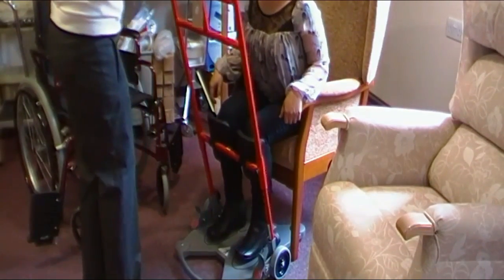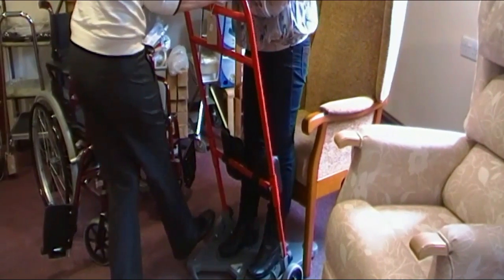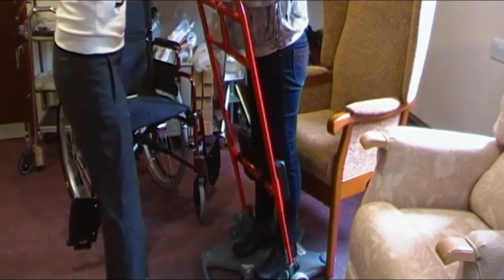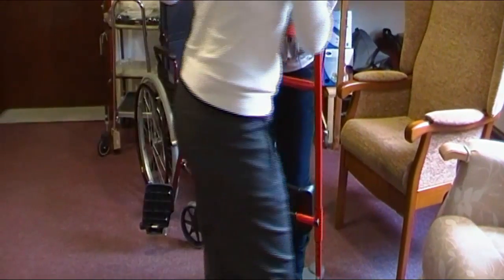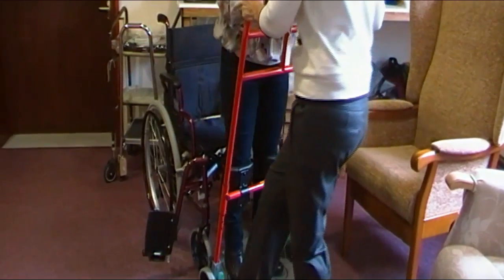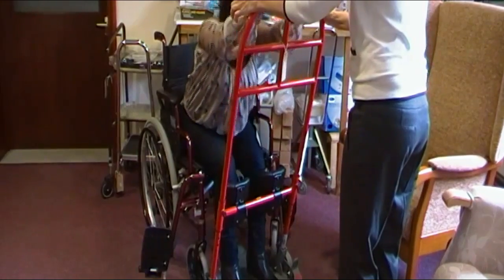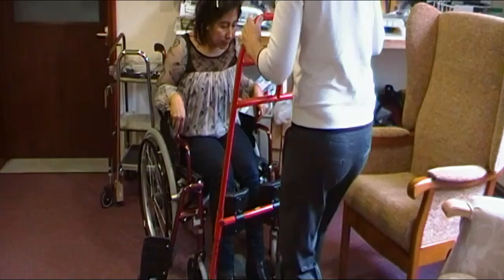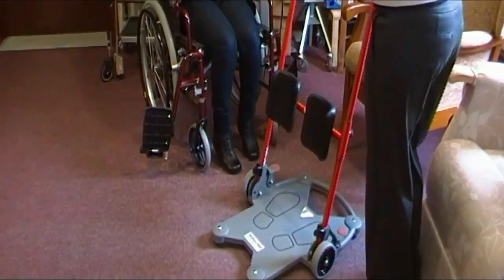And I want you to pull yourself up. Okay. And I take the brakes off, and I can move you. There is also the facility of a strap, so if the person doesn't feel too safe while you're moving, you can have a strap for it. And put the brakes back on, and then you can sit down. Okay. It has a specially designed base so that it will go round a conventional toilet.